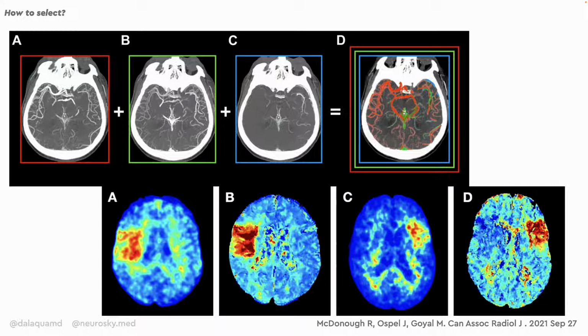And it would help less experienced observers to make the difference of each phase more quickly. So it's a simpler approach, and it's being shown more and more effective as an approach to exclude fewer patients from the intervention.